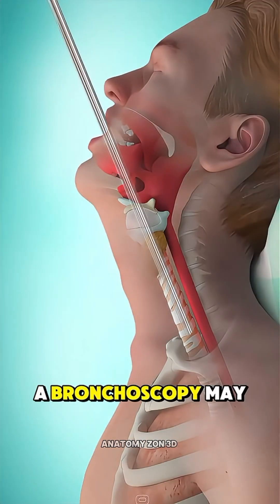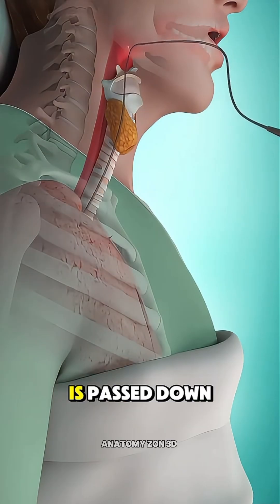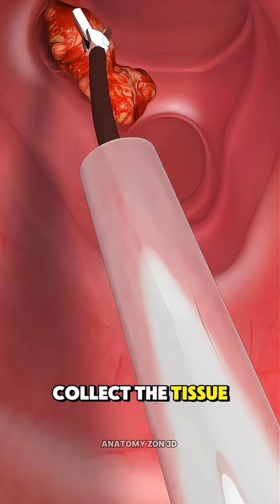If the spot is deeper, a bronchoscopy may be used, where a flexible tube with a camera is passed down the throat into the lungs under sedation, and tiny tools collect the tissue sample.